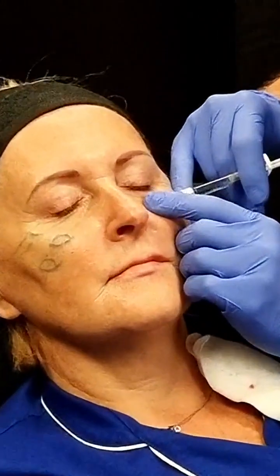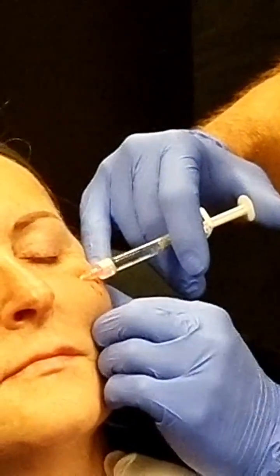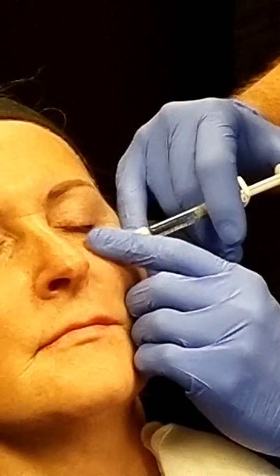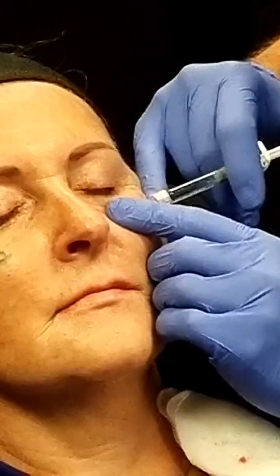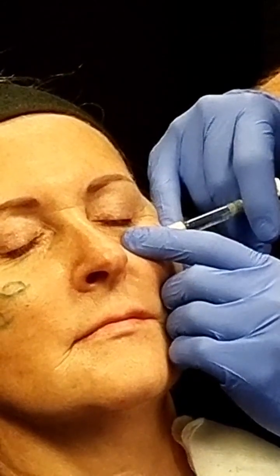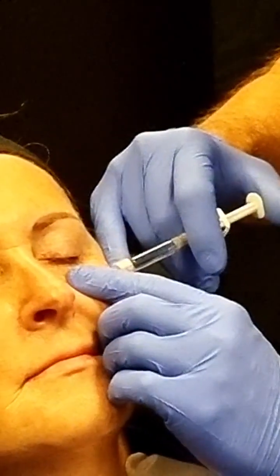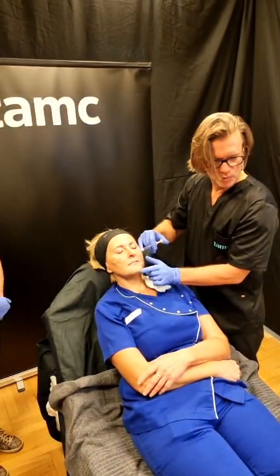Tom, we can see, it's not clear, it's your hand. So you're deep, to the bone? Nobody can see. Okay, because it's hidden. And the fact that nobody can see makes it evident that you must look with your fingertips, because I can feel the needle underneath my fingertips. So I'm sure that I'm not in an artery because I wouldn't be able to move it about.